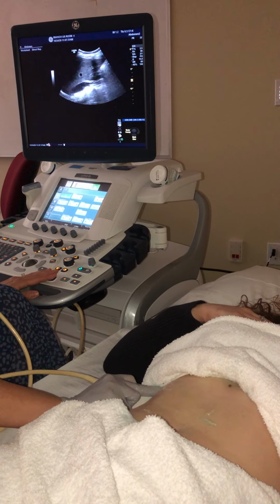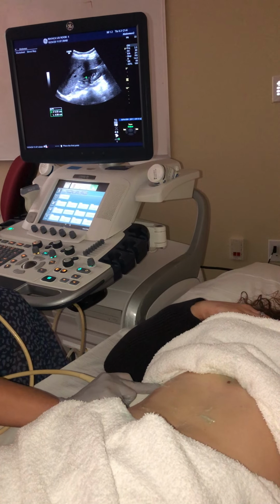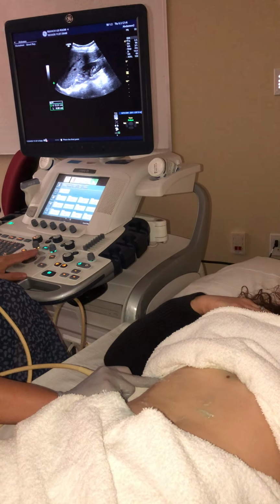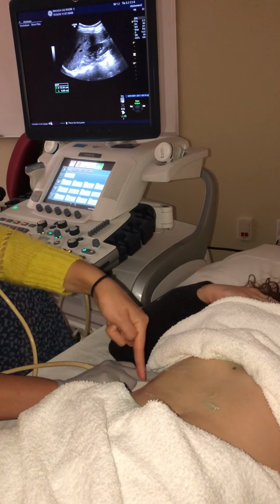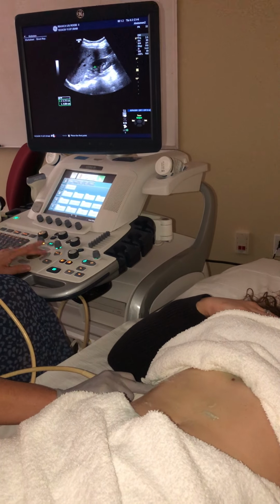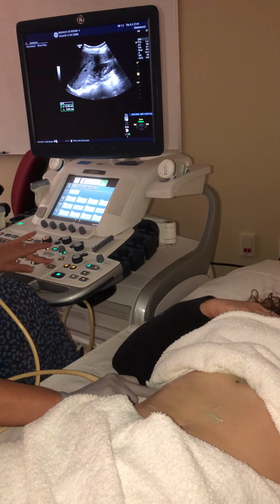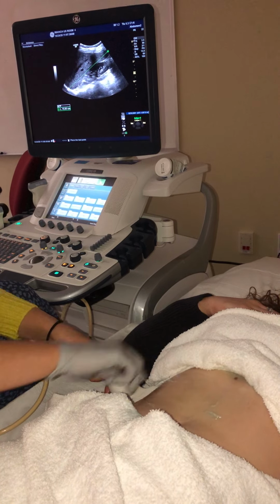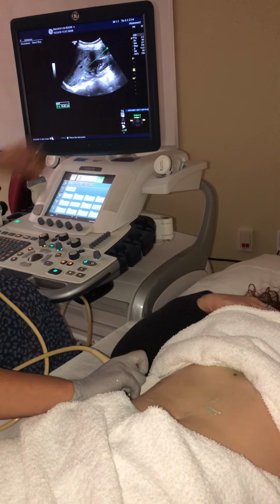We're going to get some rib shadowing as expected. We're coming in from the costal position. We're not really evaluating a lot of the liver tissue here. Remember, we're doing this for a measurement. So we're going to measure from that distal right lobe, so down here is where we're coming in this way, to up here, which is this. So this is how we're measuring her liver. And that's what we're doing on the image.